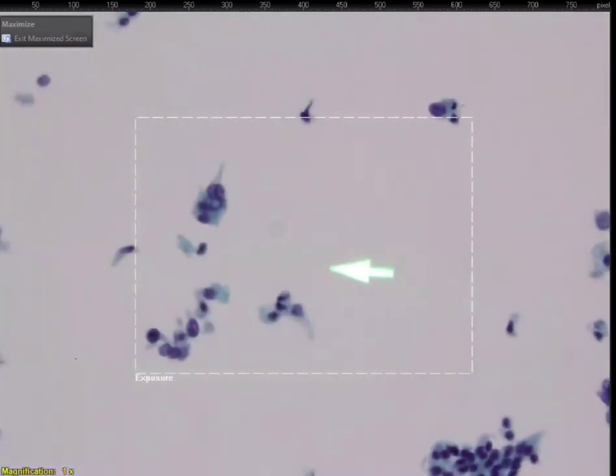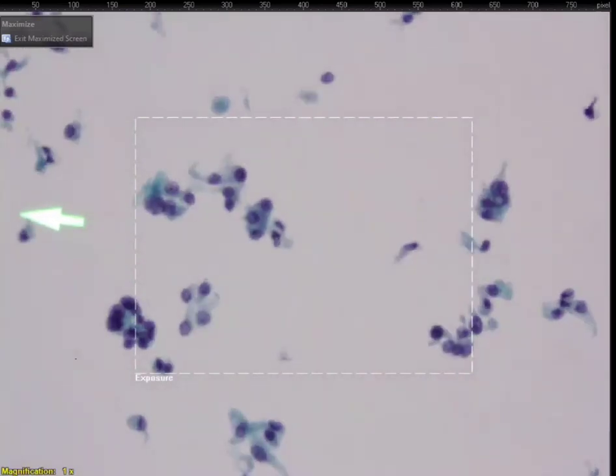Here, maybe another inclusion up here. Lots of grooves everywhere. You don't have to even look very far.